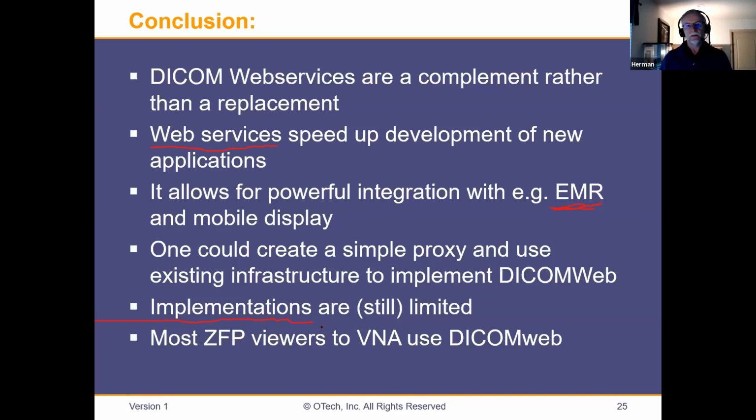But one of the things that you have to realize also is that at the IHE Connectathons, for several years, we have been testing XDS-I. We use WADO as the core. So there have been lots and lots of demonstrations, lots and lots of connectathons, meaning that we have actually validated these implementations.